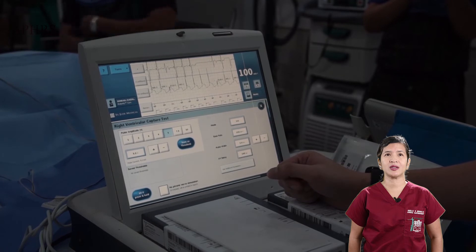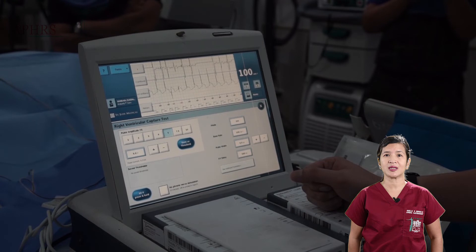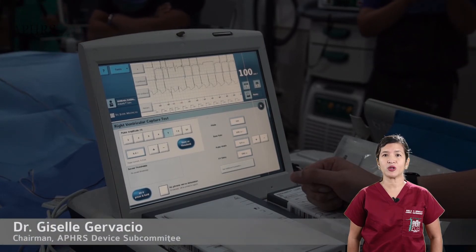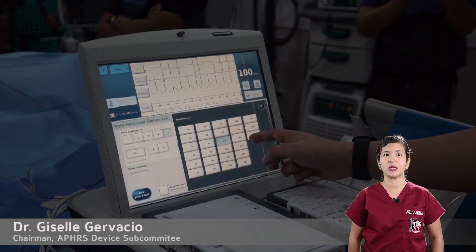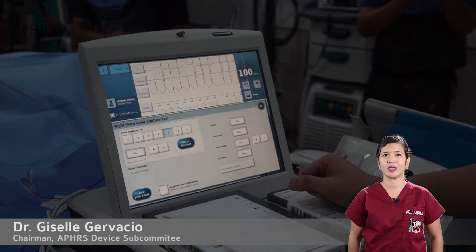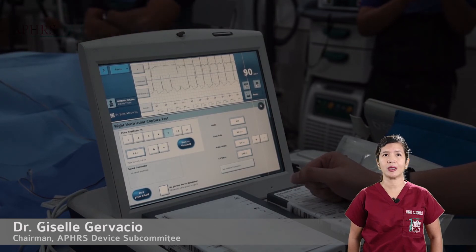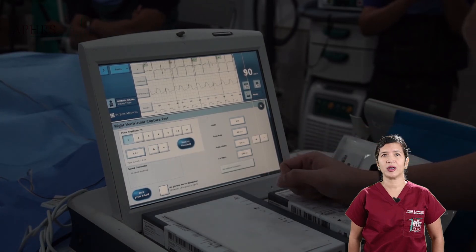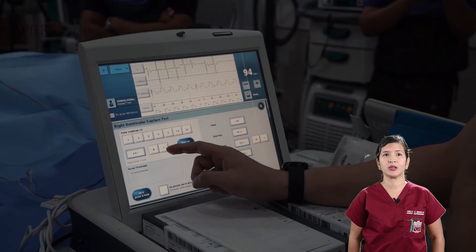The second is the performance of the capture threshold test. The pacing impedance is noted, and the capture threshold is defined as the lowest amount of energy that will depolarize the heart. This is measured by progressively lowering the amount of energy. Here we are at 1 volt and the final capture threshold is recorded.